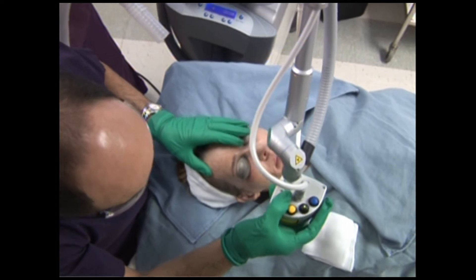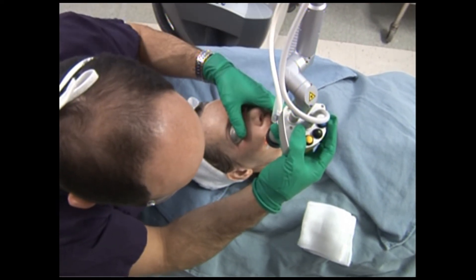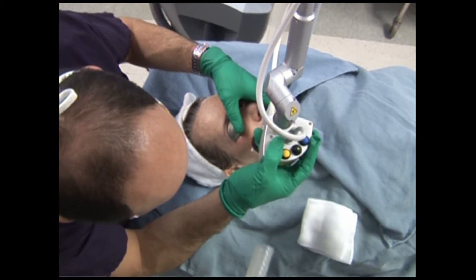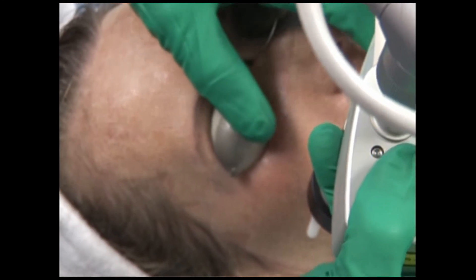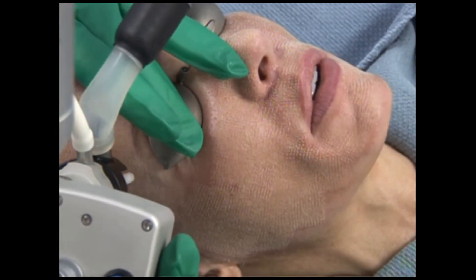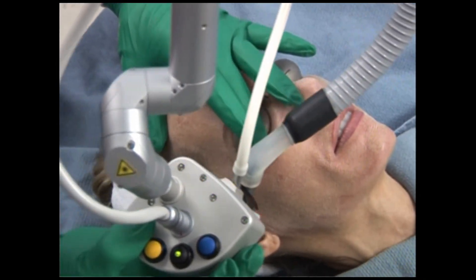These metal shields are obviously important because as we get near the eyes, we don't want the laser going into the eyes. If we want to treat the eyelids, we can put metal shields directly on the eyeball with some numbing medicine, which is surprisingly easy to tolerate, and then treat the eyelids very aggressively. We did that last time — we did the quick surface on the eyelid, which makes a big difference.